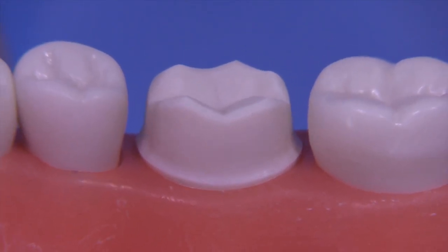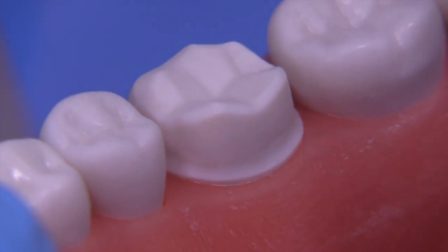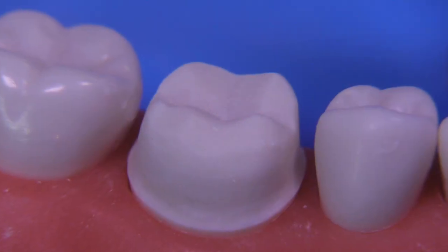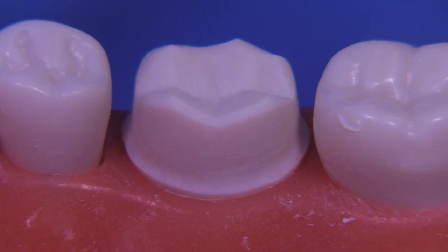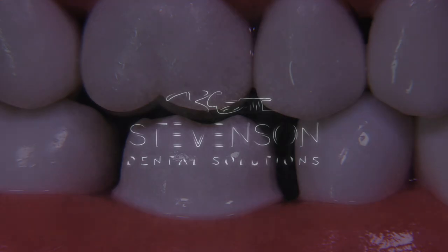One thing about the Acca-dental typodont teeth — they cut a little bit differently than the Kilgore, Columbia, and Frasaco teeth, so you want to practice on it before you go and take an exam with this typodont. I think the result was reasonable today; I certainly enjoyed prepping it and I hope you enjoyed watching. Stay tuned, give me feedback — I really like hearing from you all. Take care.